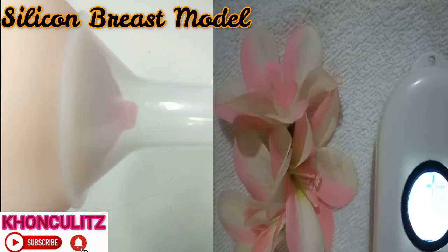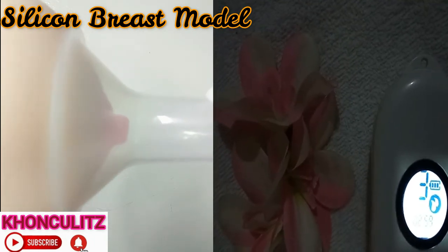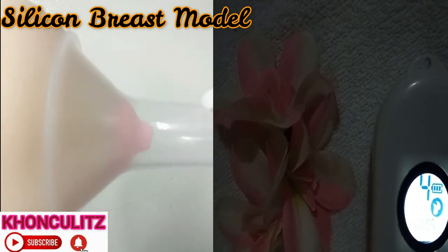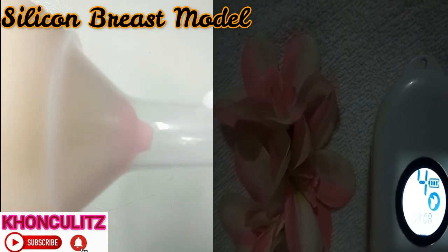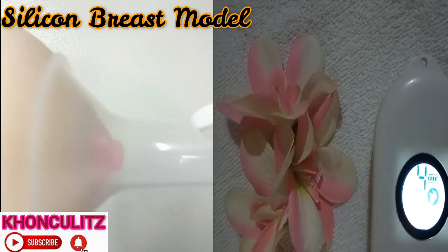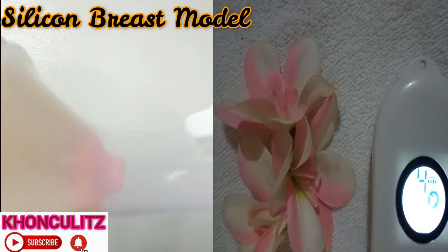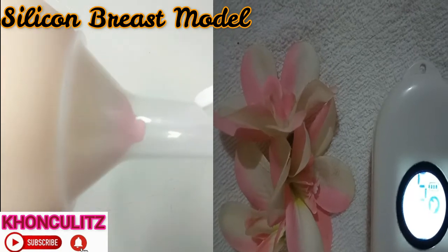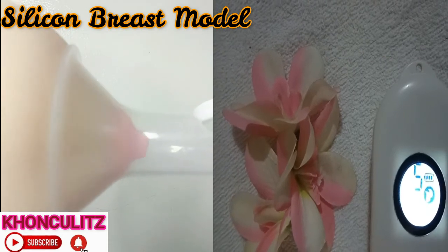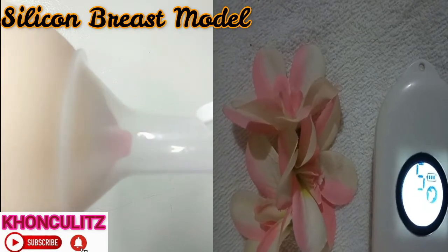Next, let's have a demo video of expression mode number four. You can see the suction. Next, let us have the demo video for suction of Wise Mom Pocket number five. What's great about Wise Mom Pocket is it's very affordable and convenient — it's rechargeable. If you fully charge it, you're on the go.